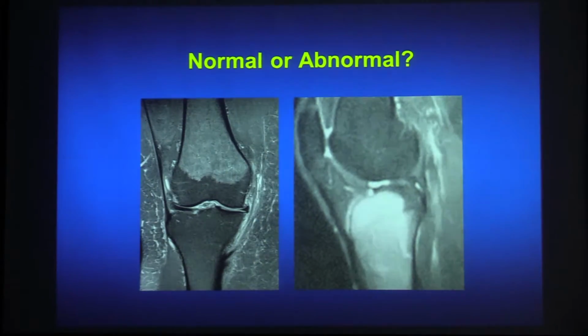I'm going to be talking to you about bone marrow abnormalities on MRI and an approach to analysis of these. So if you're a radiologist, particularly a musculoskeletal radiologist, you're looking at knees, shoulders, and hips, and you might be interested in the meniscus or the rotator cuff, but the bones are included, and included with the bones is the bone marrow.